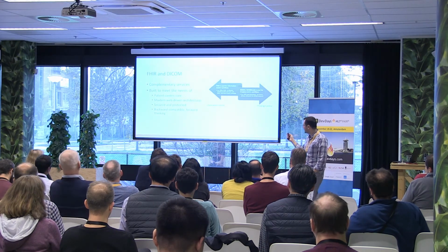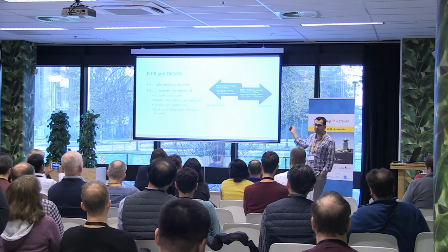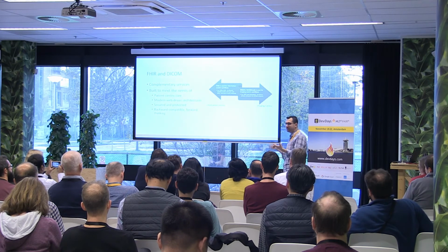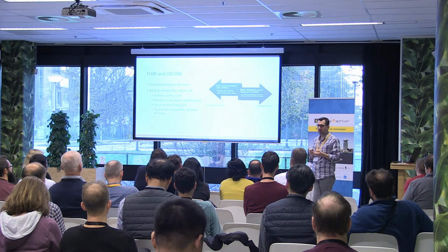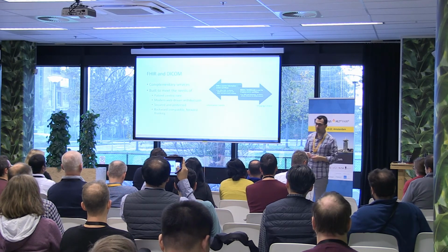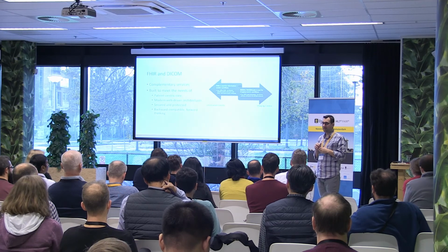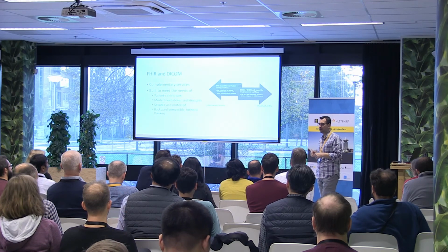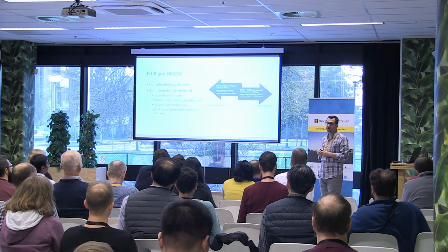And conclusions, very quickly. So I hope by now you understand what the difference is. So the majority of your workflow is done in FHIR, but when you get to the imaging part, it's DICOM. Obviously, both are standards that are using RESTful interfaces, so modern web architecture. But keep in mind, DICOM stands out because of the fact that it's backwards compatible. So, somebody like a PACS vendor could release a new version of their PACS, which now suddenly supports DICOMweb. The other nifty use case about DICOMweb being backwards compatible is if your PACS vendor doesn't have it, there are open source projects that can give it to you. You can put a piece in front of your PACS, and now suddenly it speaks DICOMweb, which makes it super convenient. So anybody needs DICOMweb today and your vendor doesn't give it to you, you have options.